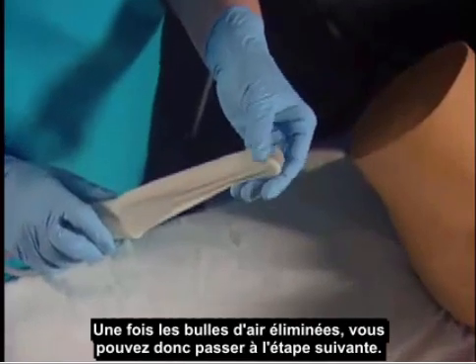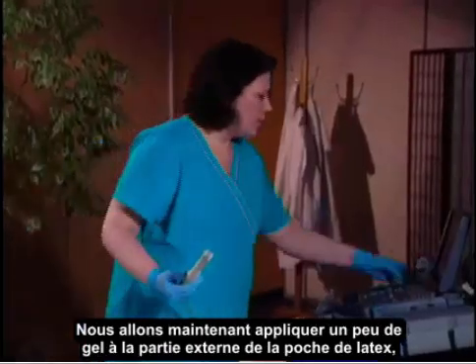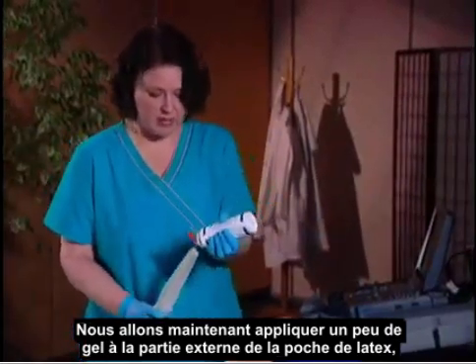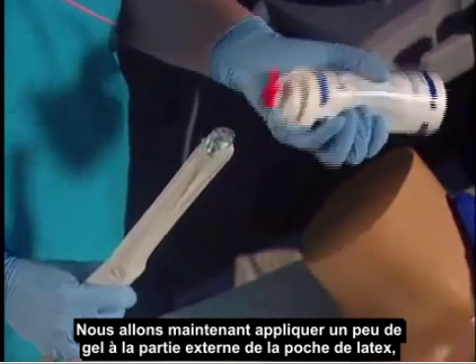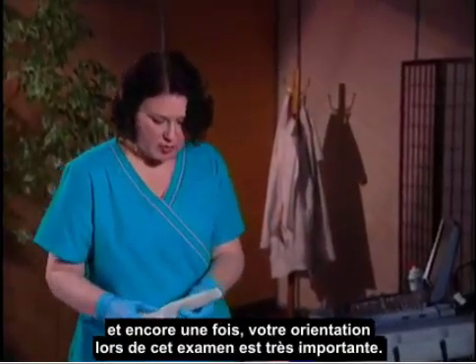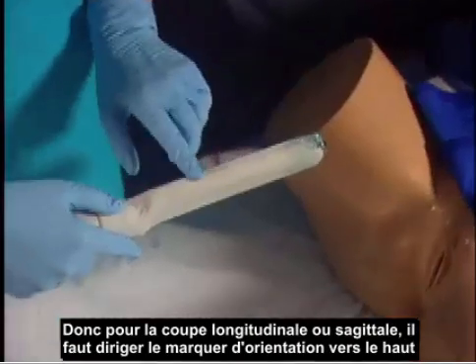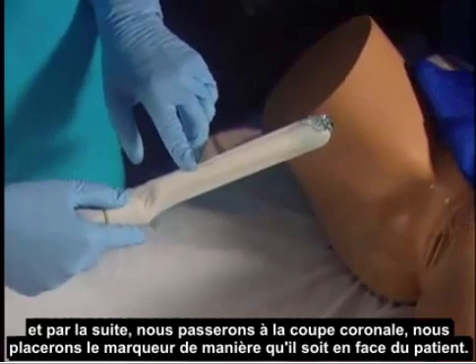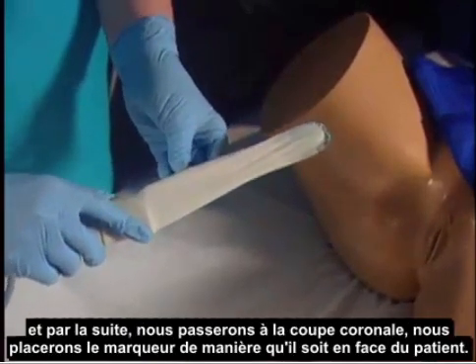Once the air bubbles are eliminated, put a little bit of gel on the outside of the latex cover. Orientation for this examination is very important. For the long axis or sagittal view, the orientation marker should face up. When moving to the coronal view, turn it so it faces the patient's right.